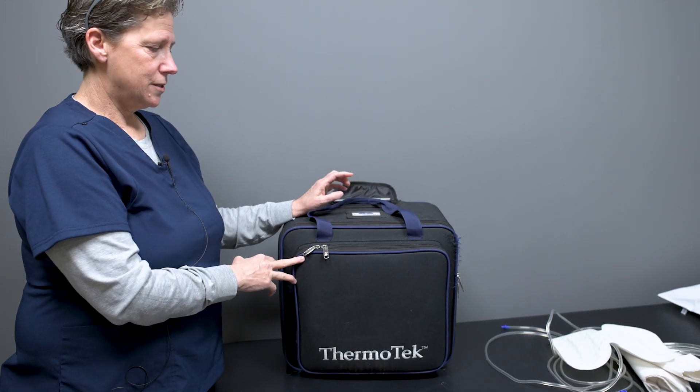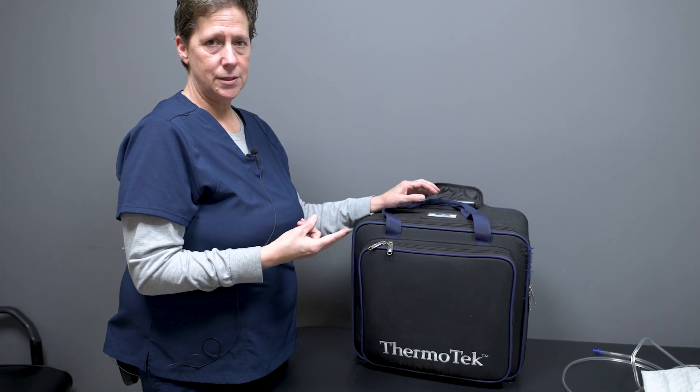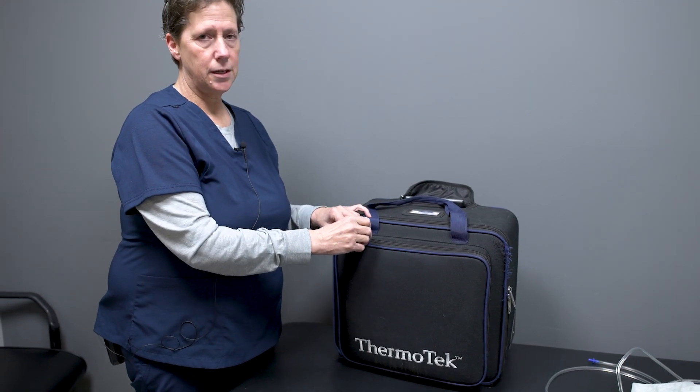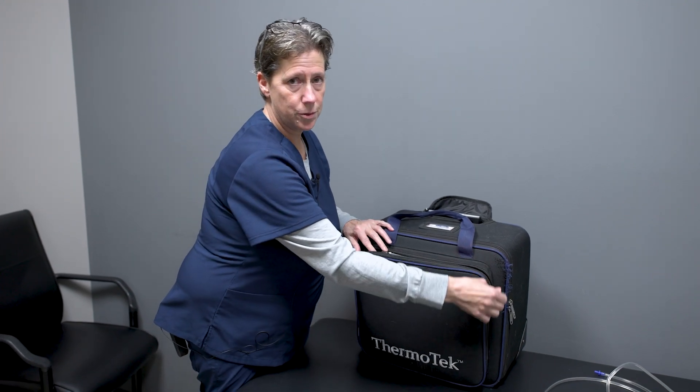The VascoTherm machine is a dual-purpose piece of equipment that, on one hand, applies pneumatic compression to the calf and helps prevent blood clots from forming, and on the other hand, it has an internally cooled device that, once it's plugged in, will apply thermotherapy to the leg without having to add ice or do anything else. So it's cold therapy on top of DVT therapy — DVT is basically warding against blood clots — so it's a very important piece of equipment.